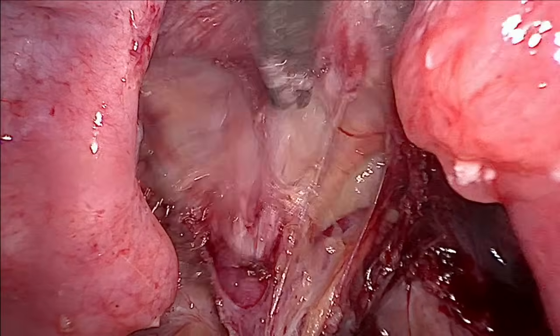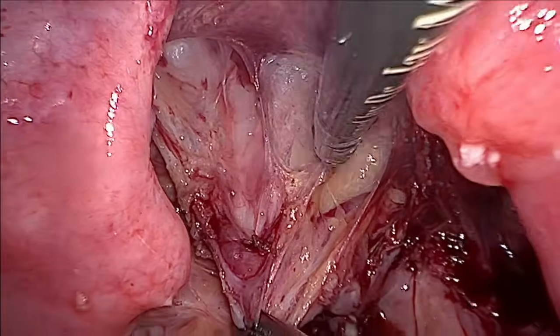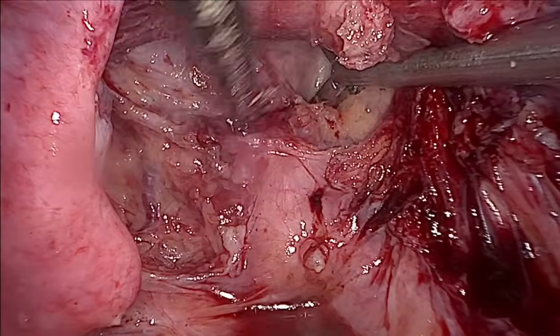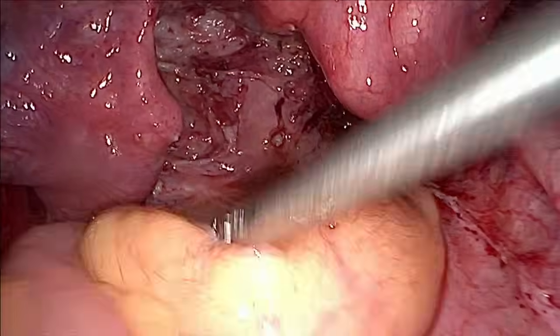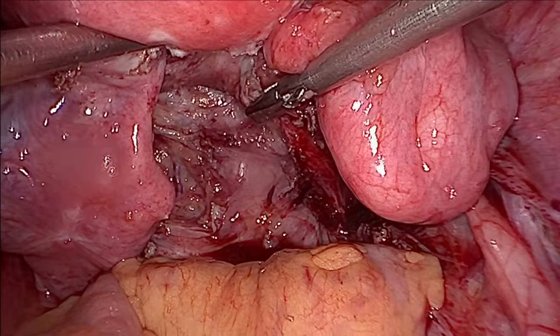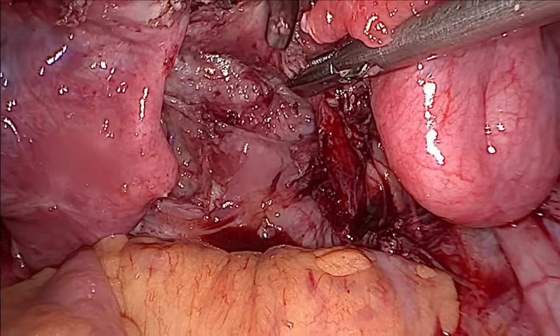Okay, you go, you dissect. Okay, so the rectum dissection is done. Okay, you can see the rectum, and now as I know that the rectum is quite far away, okay, I can just go and remove this peritoneum.